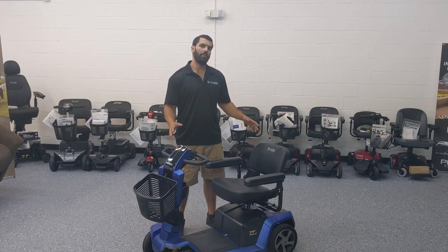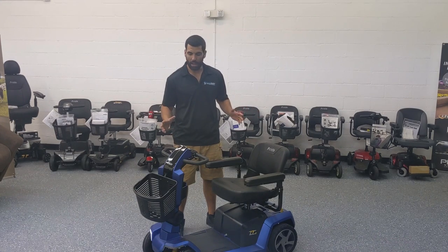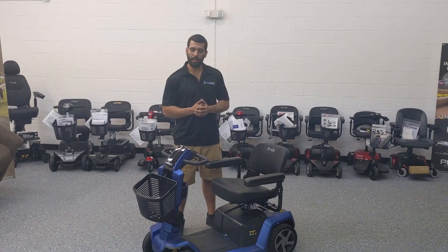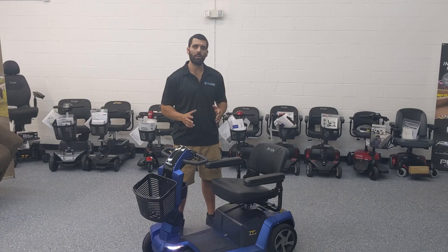This is considered a heavy-duty, full-size scooter — definitely not a lightweight, compact one by any means. It can hold up to 400 pounds and, depending on the weight of the user, goes about 18 to 24 miles on a full charge.